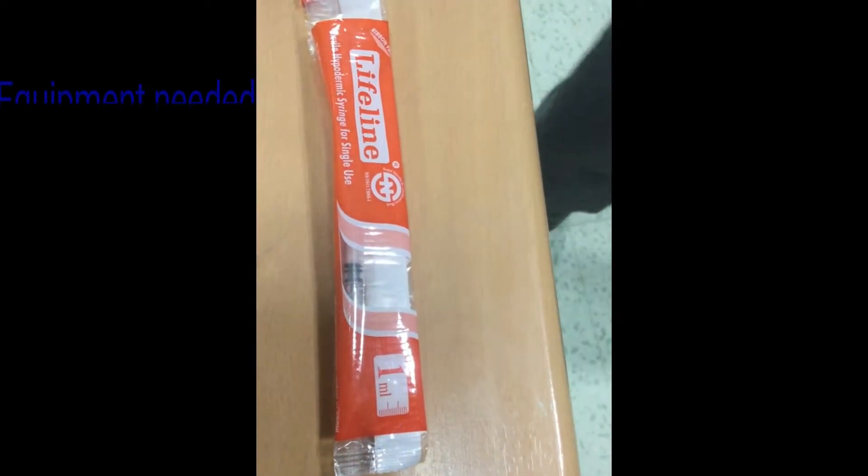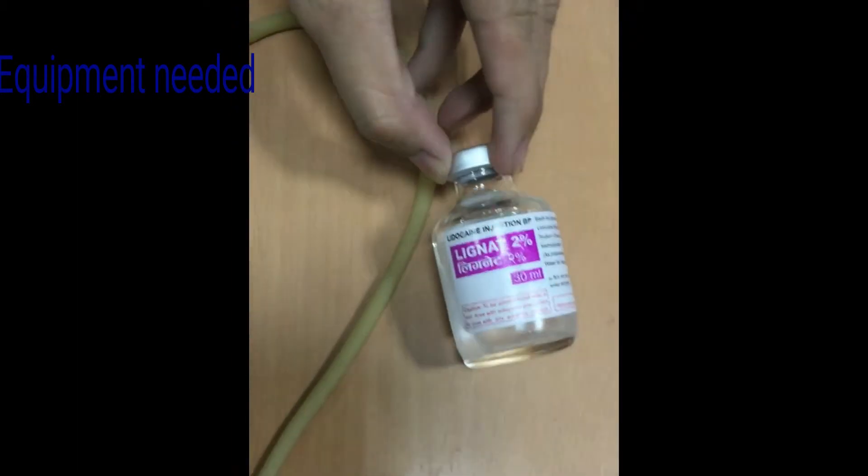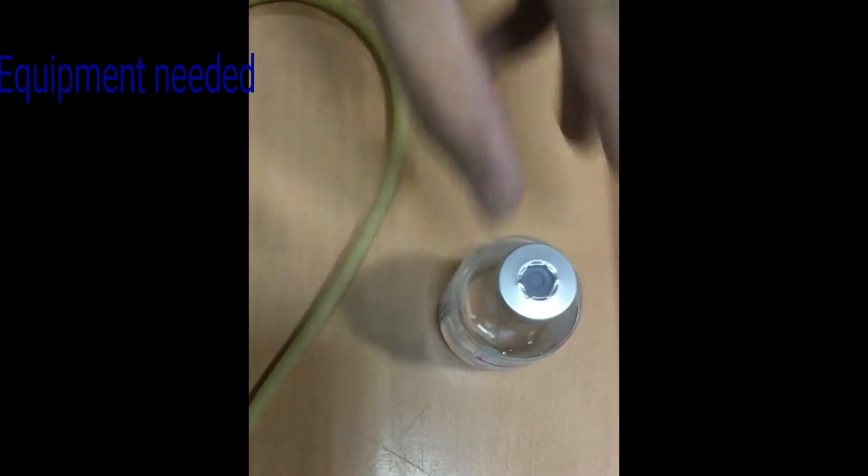Equipment needed for IV cannulation: 1 ml syringe and lignocaine 1-2% if local anesthesia is to be used.